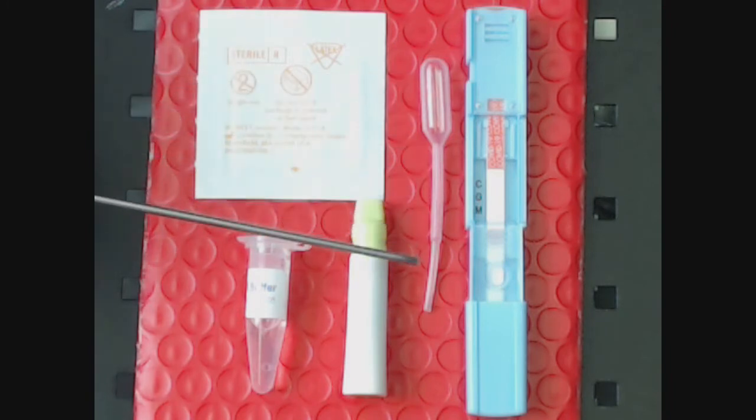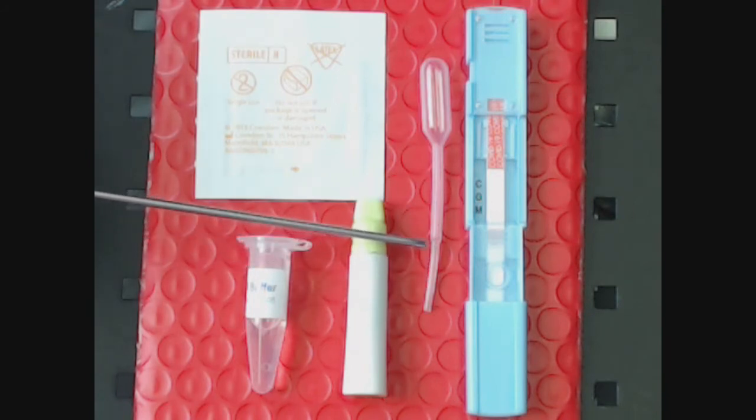This one works very well. When you're drawing the blood up, just draw it up right in the distal aspect of it. Then as soon as it's drawn up in this small part, just put it right into the cassette.